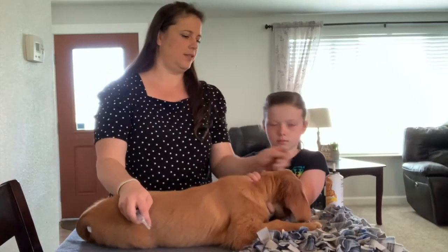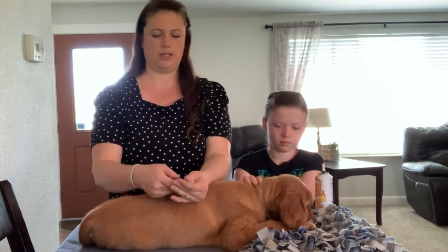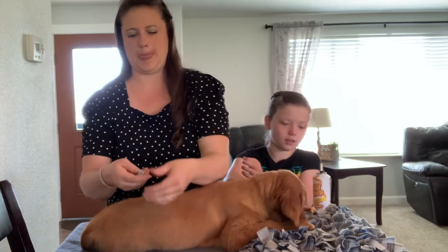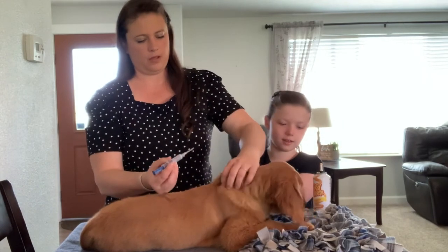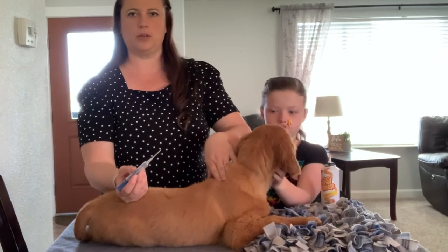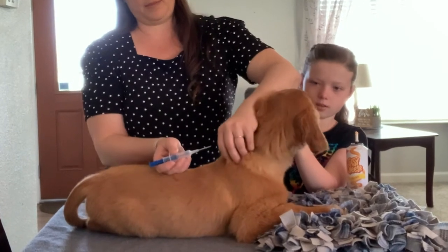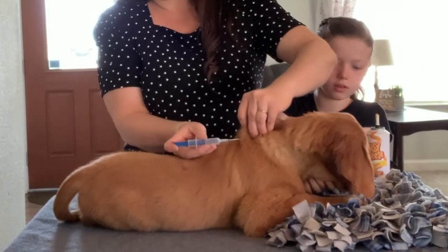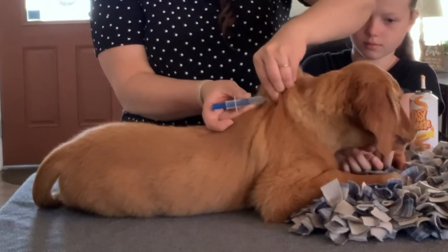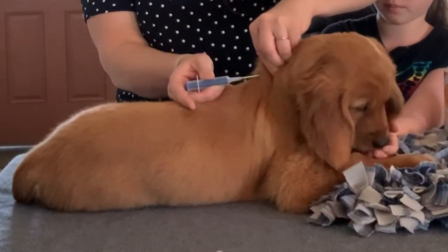Jillian is going to make sure she's distracted with the dog food and give her some cheese squeeze, which is her absolute favorite treat. We want to put the microchip right here in her neck — we feel where the shoulder blades are, lift up the skin, and go parallel with her skin.